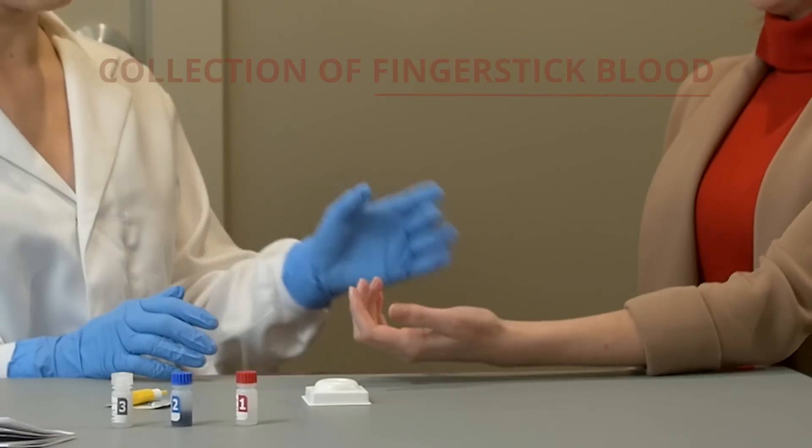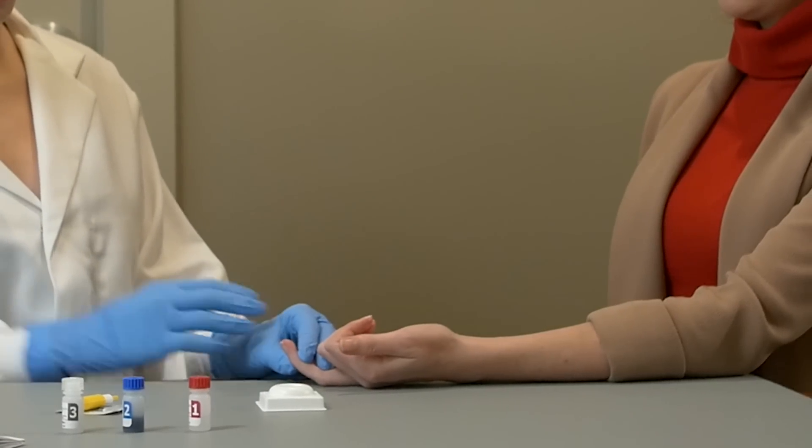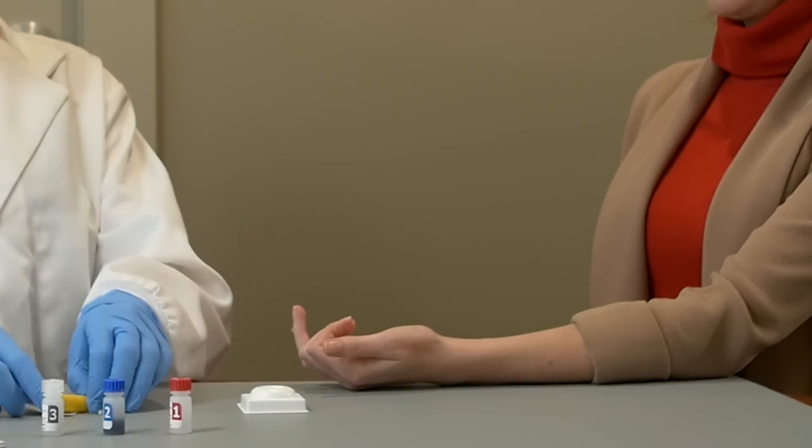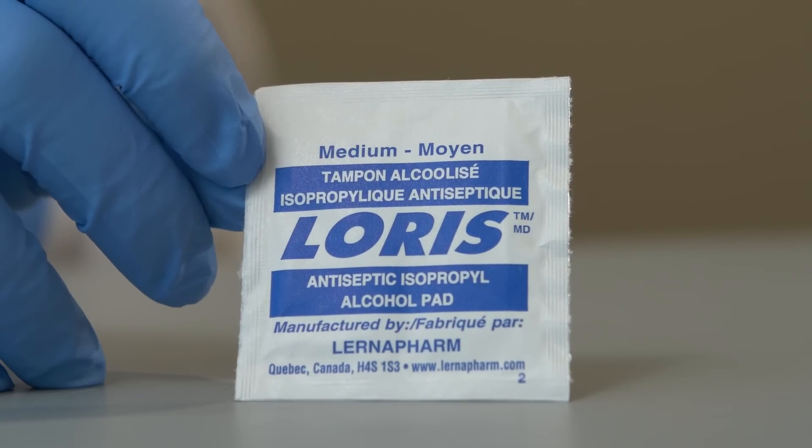Position the patient's hand in a way that is comfortable for the patient and allows you to easily press his or her finger to collect blood. The hand should be positioned at waist level or lower. Wipe the fingertip with the provided alcohol swab.